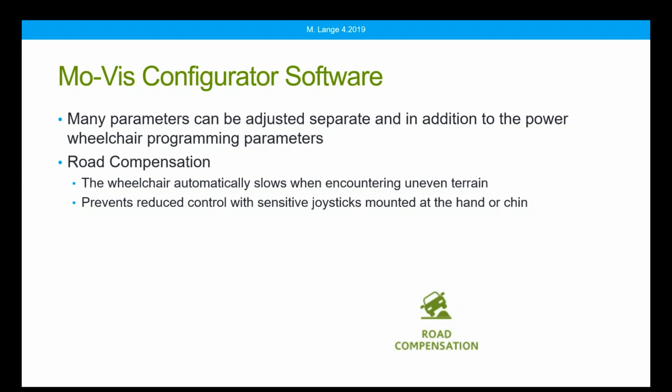Now, if this gets in your client's way for any reason, you can always turn road compensation off, but it is one of the many proportional or programming options.